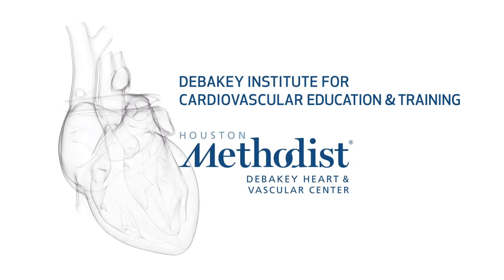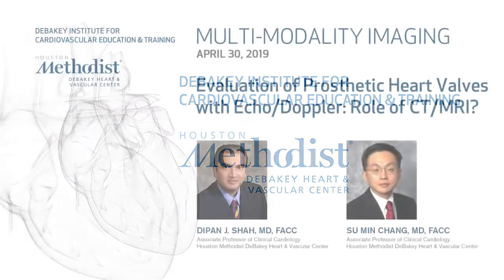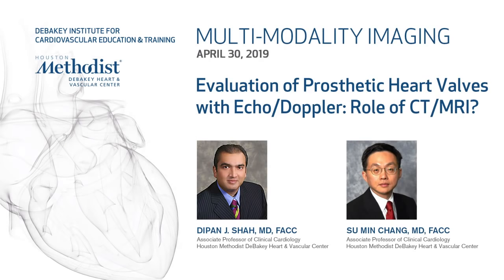Well, it's obviously impossible to cover in 50, 55 minutes the whole topic of prosthetic valve evaluation, so I'll do my best. There's a lot of valves, so I'm not going to go through every single one of them. I think we know most of them by prosthetic valve, mechanical valve. Obviously, now we have all the percutaneous valves, so we just have to keep reading and learn about the new valves, but we're going to talk about the most commonly implanted valves.